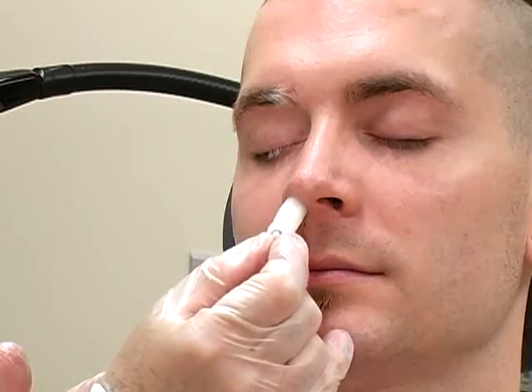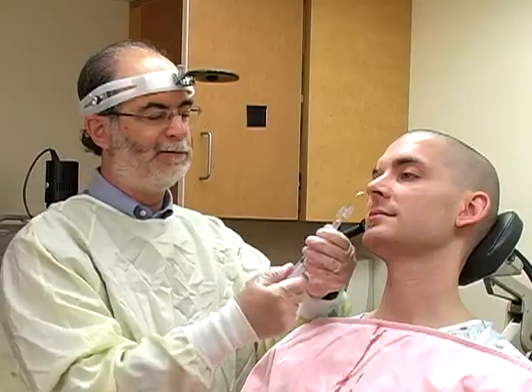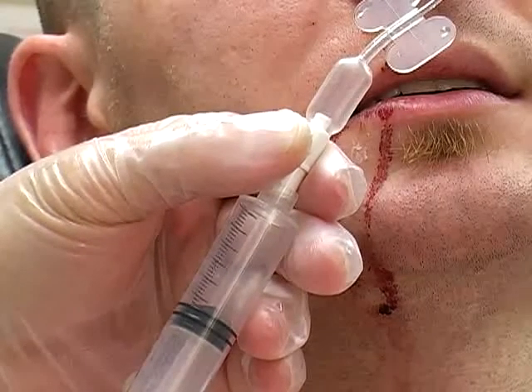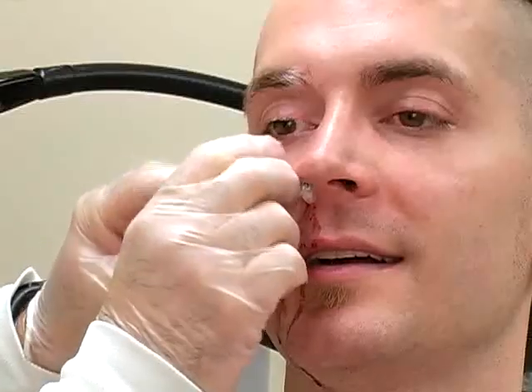Insert the device at a 45-degree angle and advance it 1 or 2 centimeters. Then bring it perpendicular to the face and gently insert it parallel to the floor of the nasal cavity. Once the device is fully inserted into the nose, use a 10 milliliter syringe to inflate the balloon with air. The volume of air required will vary by patient. Use the pilot cuff on the exterior of the device to estimate the pressure exerted by the balloon. Finally, secure the inflation port to the patient's face using tape or a transparent dressing.